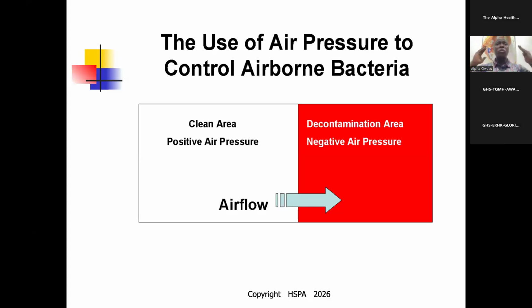So if we come there, these are the practices. We are going to check the temperature, the humidity, and the air pressure. These are all going to be standards. You remember, this goes under the HVAC system of the facilities. There are peculiar air pressures and temperatures at all these areas. We will get to them right now.